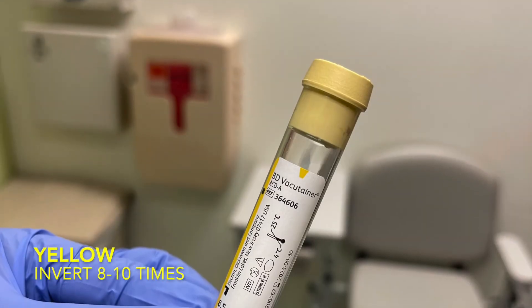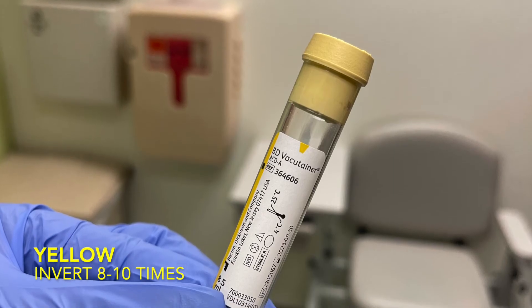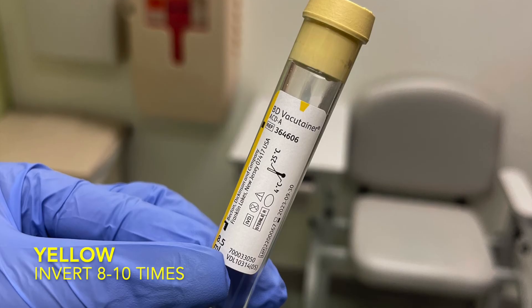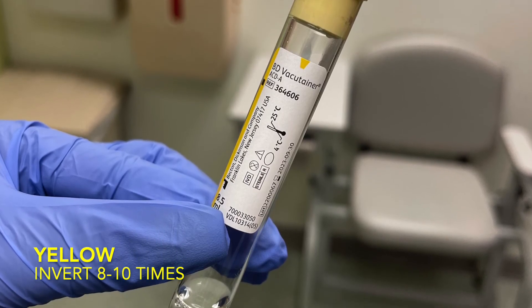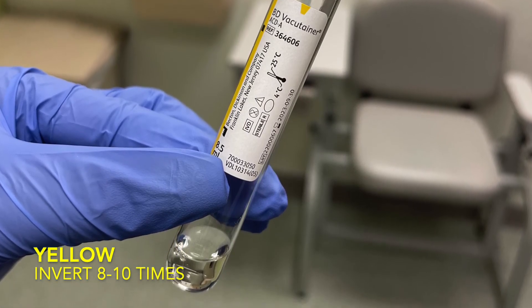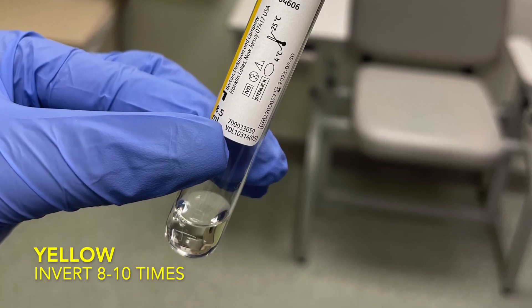As an honorable mention, this is an ACD yellow top — it comes after the gray top. It contains citric acid, dextrose, and trisodium citrate and usually comes in a glass container. It is used for DNA, paternity tests, and HIV cultures.